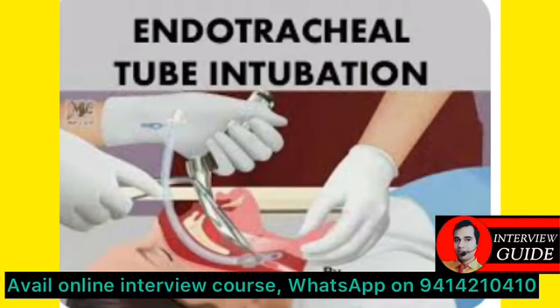If everything is okay, we have to position the patient. If the patient is atraumatic, we position the patient in the sniffing position, that is, we extend the head slightly and flex the neck slightly. If the patient is traumatic, it's very important to immobilize the neck and head and keep the patient in that position only. The patient should be totally immobilized at the time of intubation if traumatic. In atraumatic patients, we put the patient in the sniffing position, as I have told.